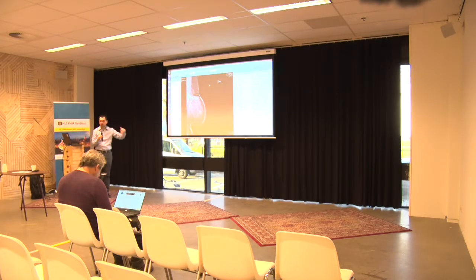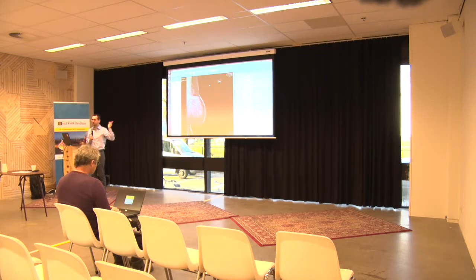So again, a viewer like Micro DICOM, it's nice because it just shows you the image. But if you ever have to show this image yourself, you will find that it's pretty significant effort. So first of all, this file here was actually 26 megabytes. This is just one image. And this is in fact not really that big. A lot of mammograms can be a lot bigger. I've seen mammograms as big as about 1 gigabyte. So it can be very intense.